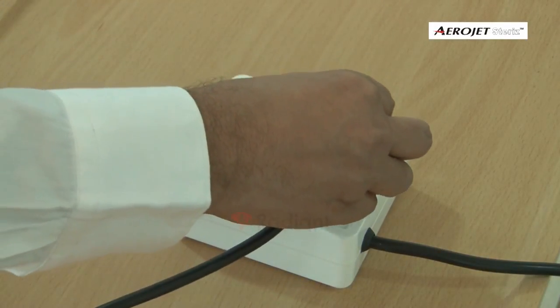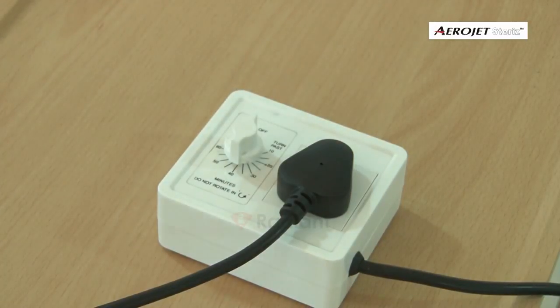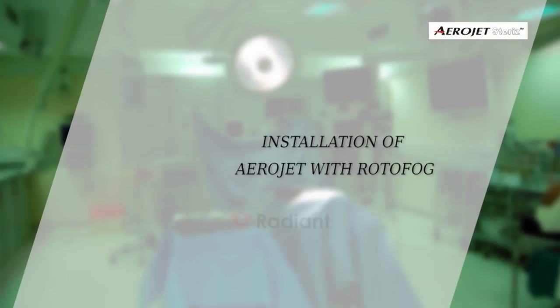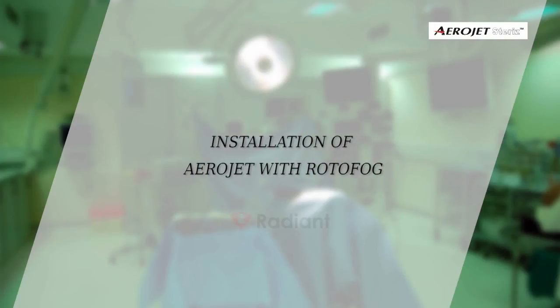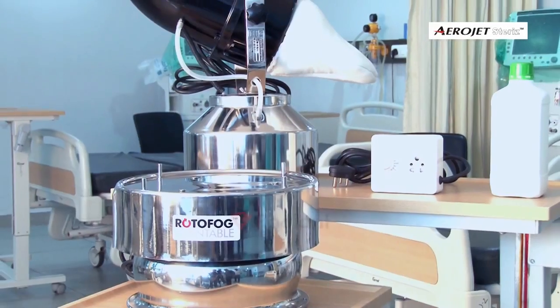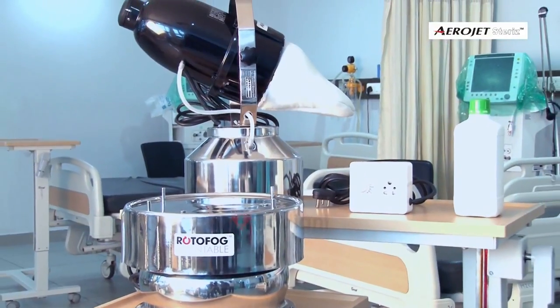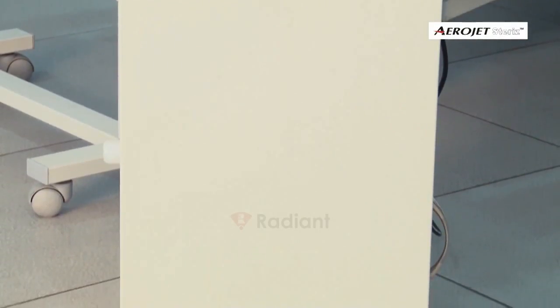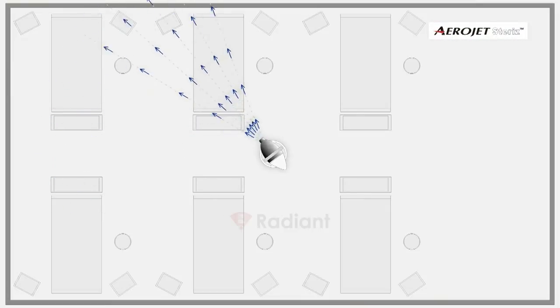Connect the power cable of the machine into the timer socket and the timer cable into the power mains. For installation of Aerojet with Rotofog: if you are planning to use Rotofog with Aerojet, place Rotofog on a steady table at three feet height, preferably in the center of the room.